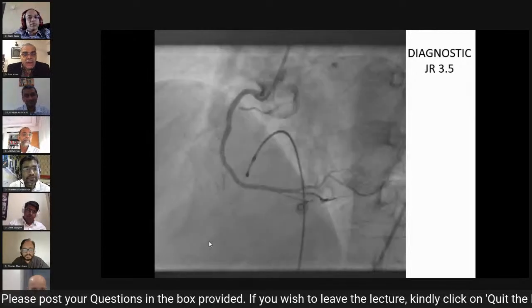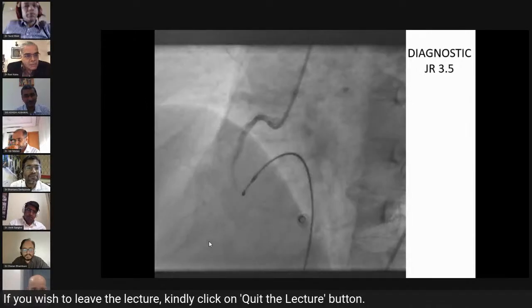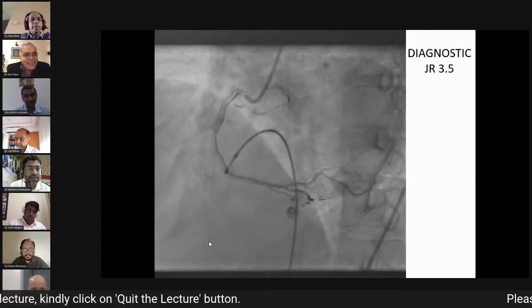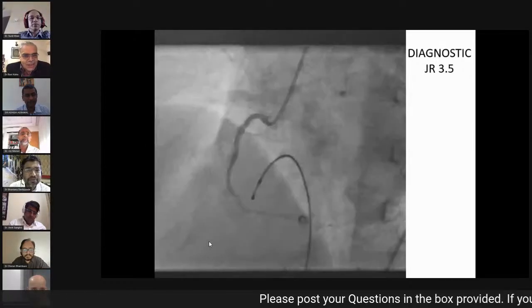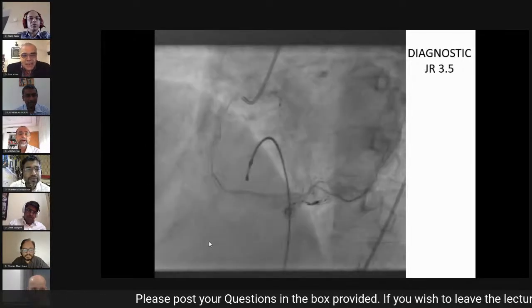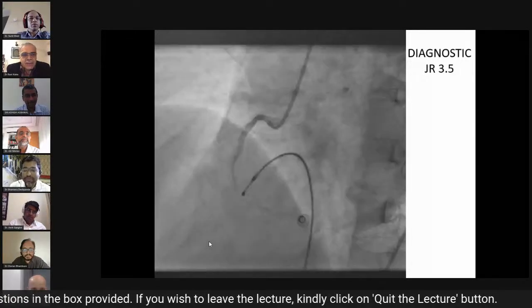I would have chosen rota as the first, for various reasons, mainly familiarity. Yeah, because calcium, rota, as far as we're concerned. These are all new technologies, of course, we can combine, we can think of various things, but rota is the gold standard for me.